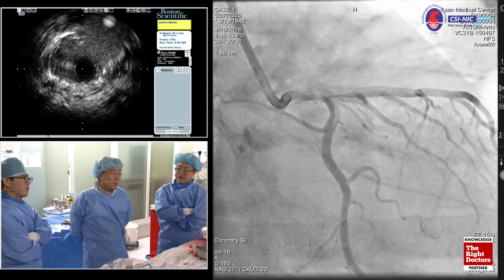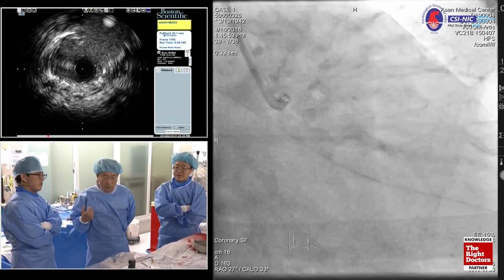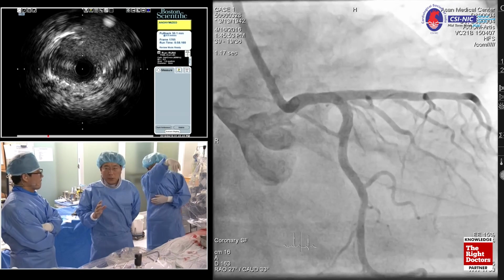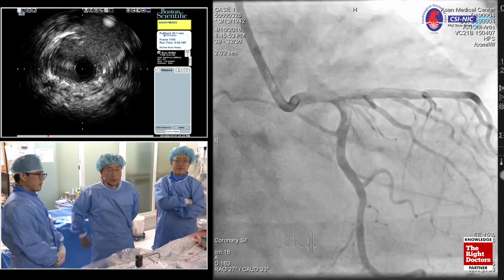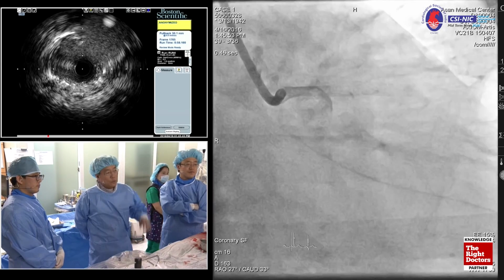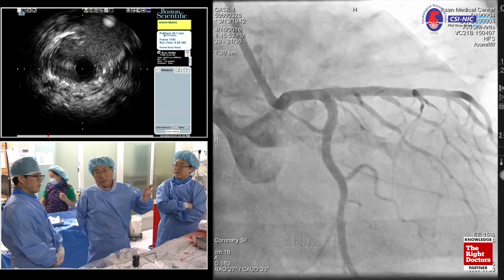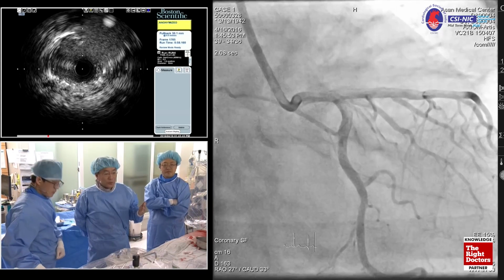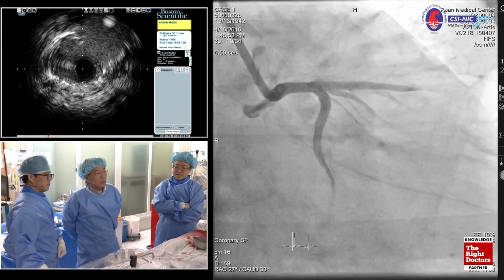All right. So we don't have any solid answer for that ISR cases, DEB and another drug-eluting stent. So now, we are conducting, almost 80% patient enrollment, a randomized study with a drug-eluting balloon versus another drug-eluting stent for ISR lesion. So we're going to have some answer in the near future, and still I believe too much metal is not so good, rather than less metal. And always, from a practical point of view, I prefer the DEBs rather than another drug-eluting stent.